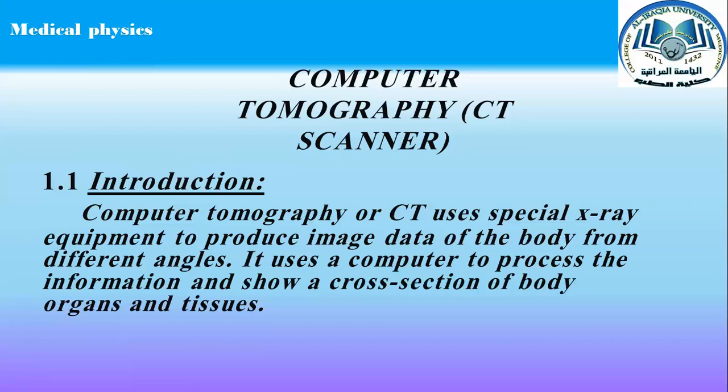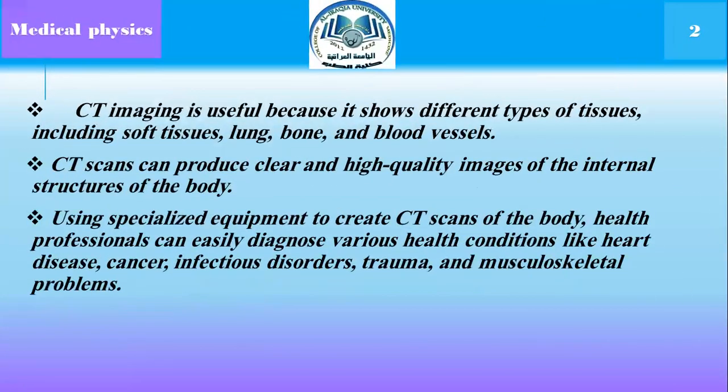CT scan imaging is useful because it shows different types of tissues, including soft tissues, lung, bone, and blood vessels.